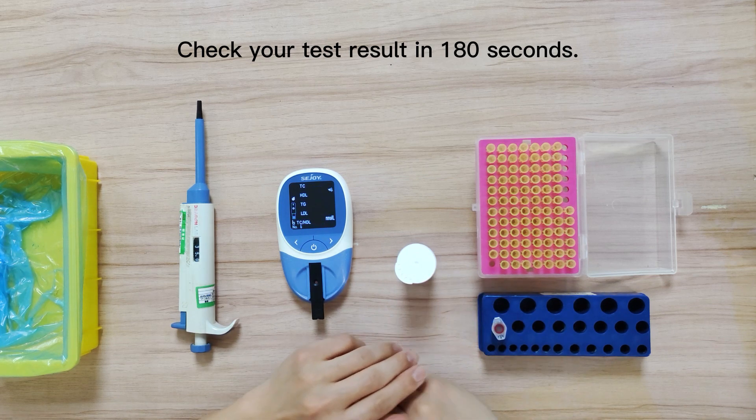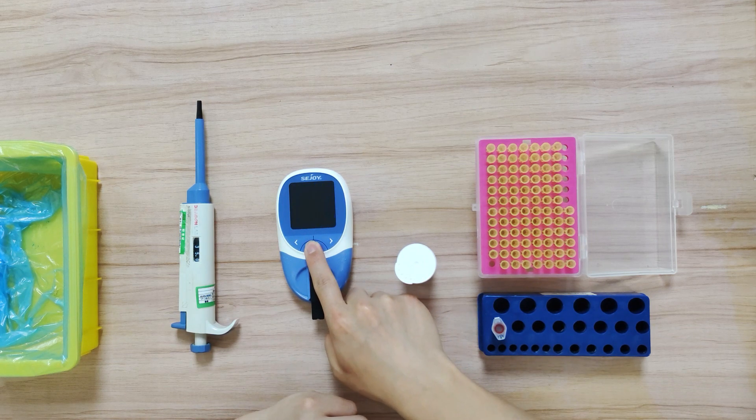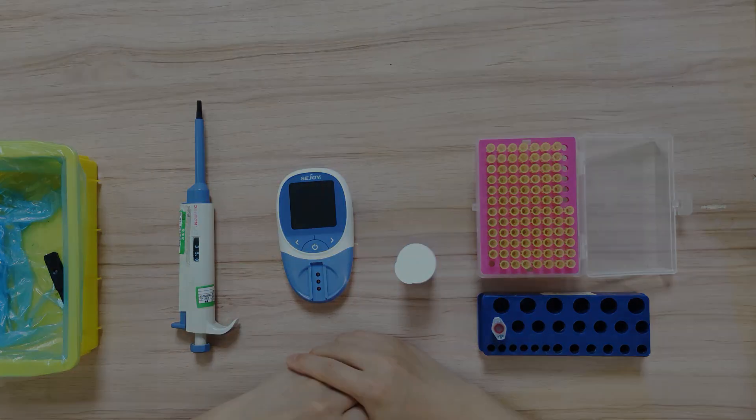Tests will be automatically stored in your meter. Pull out the used cartridge and quickly dispose of it.